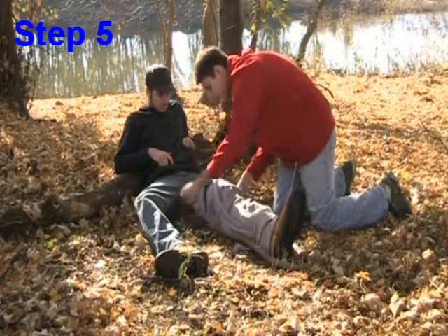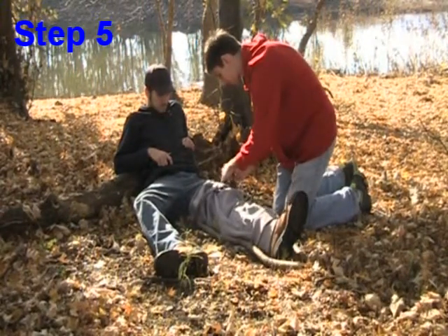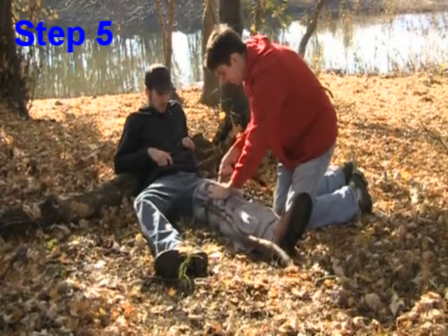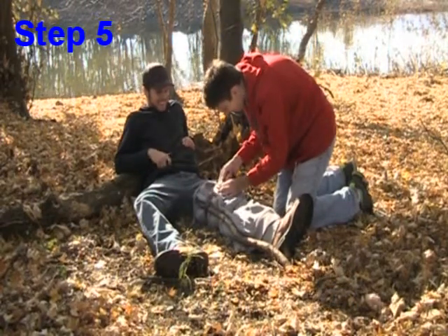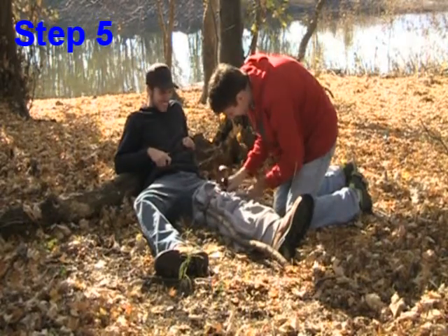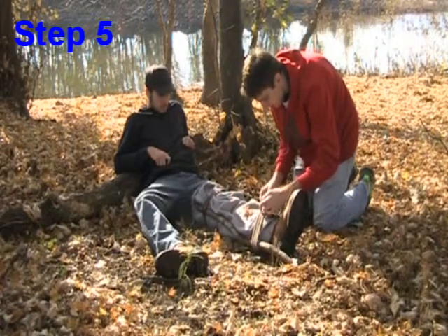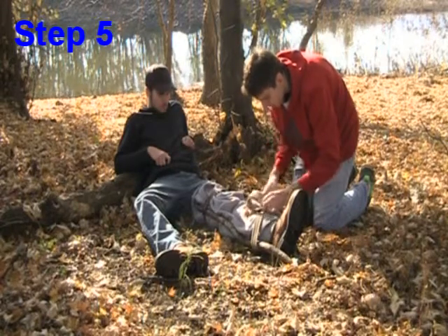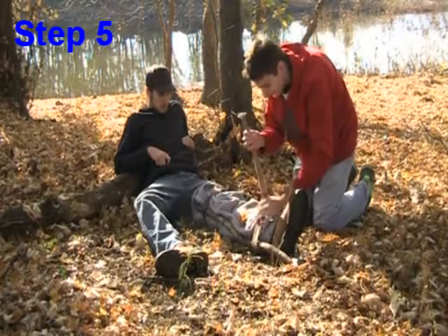Proceed to use your securing devices, in this case belts, to secure the sticks in place, one above and one below the injury. Don't secure the straps too tight around the leg to prevent loss of circulation. You do not want to tie the brace over top of the area that is injured. In the event that you do not have 2 belts, some other options that can be used are shoestrings, lanyards, or extra clothing material.